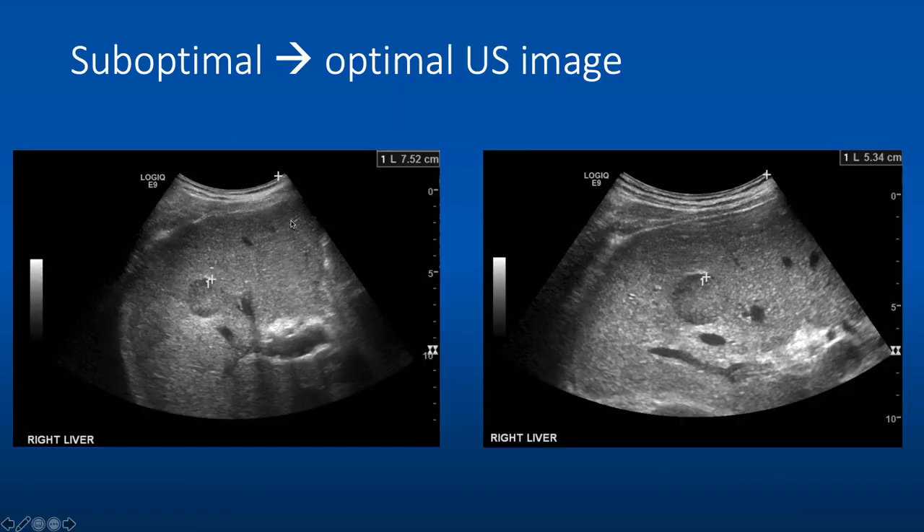Here's an example of an image that was not optimal for a procedure. You can see a liver lesion with a lot of image below it, when really we're just interested in the lesion and a little space below. We decreased depth from about 15 centimeters to about 10 centimeters and adjusted the focal point to just below the area of interest. These are two ways to optimize your image.